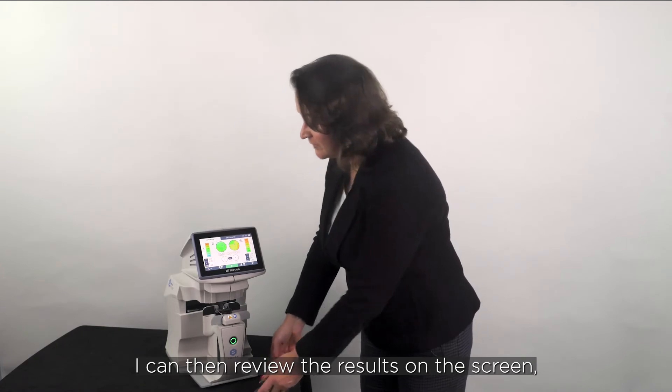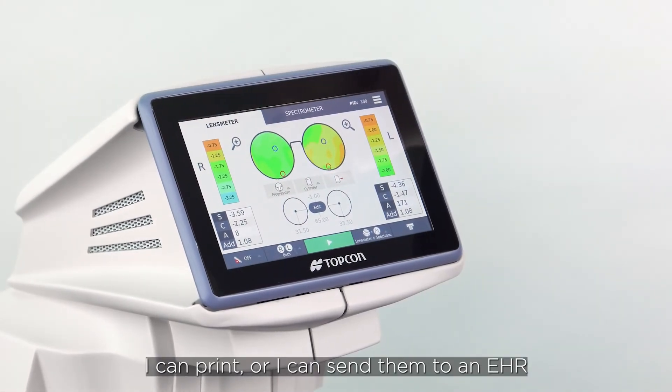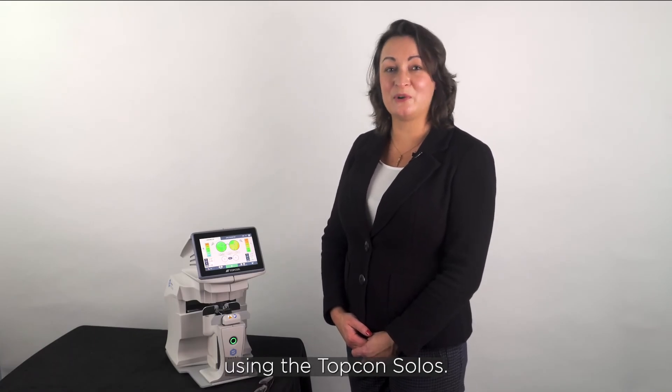I can then review the results on the screen, I can print, or I can send them to an EHR, CV5000 Digital, Focapta, or the Kronos binocular refraction system. And that's how you analyse a pair of spectacles using the Topcon Solos.